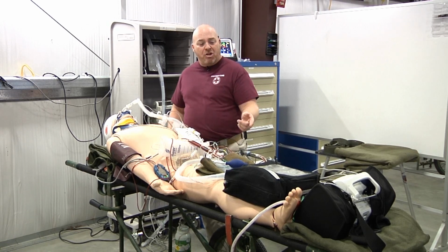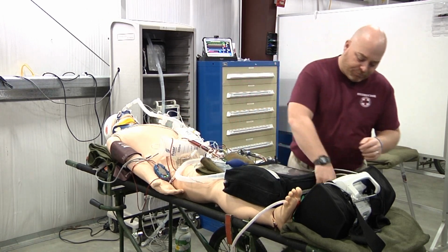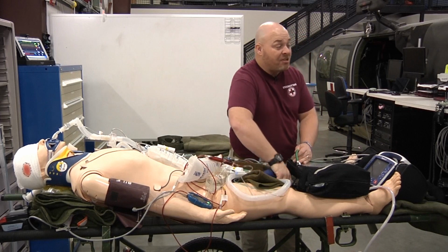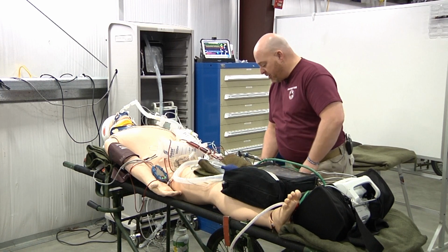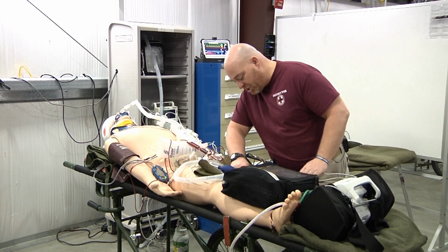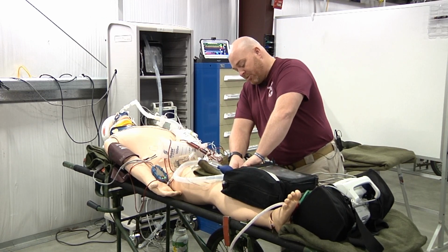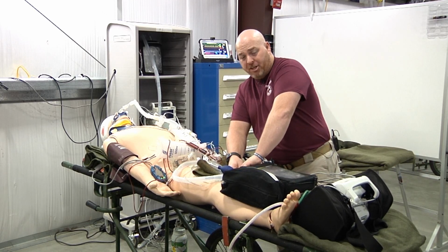During this time when we've had our patient on the vent, we've had the patient running off the hospital's O2 to conserve our oxygen. So we're going to go ahead and make that transition now because we're getting ready to wrap them, make sure they're all bundled up and ready to go. So we're going to swap over to our oxygen, and this starts our clock for oxygen. Typically, with the D-size cylinder, on a ventilated patient, based on pressure and FiO2, we estimate 20 minutes of oxygen, but that's going to change based on your FiO2 and how much pressure is already in your tank. So just ensure that you're monitoring your PSI closely.